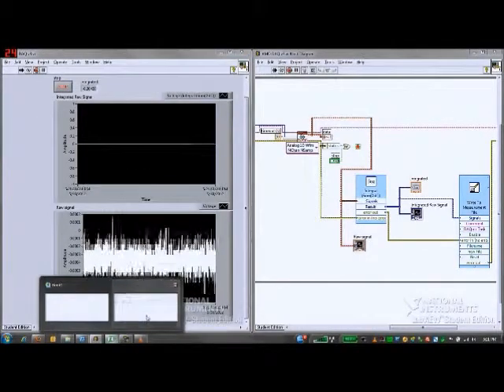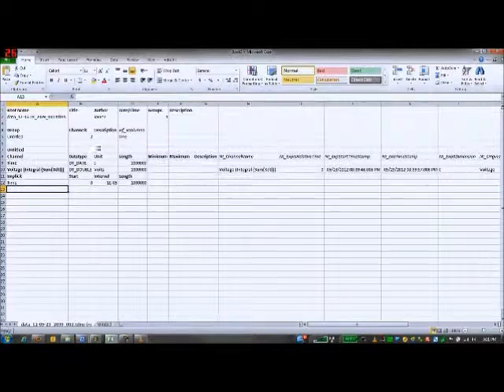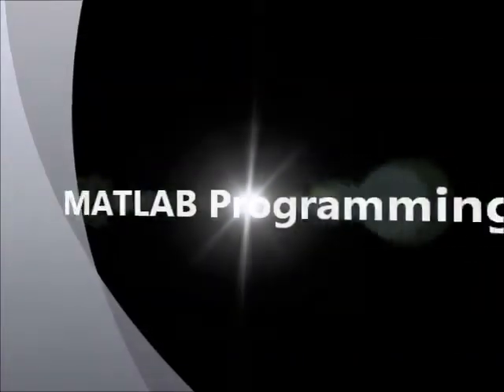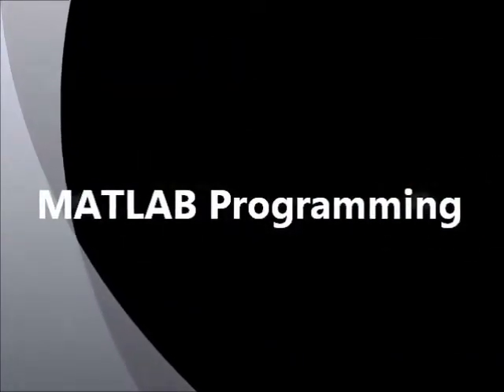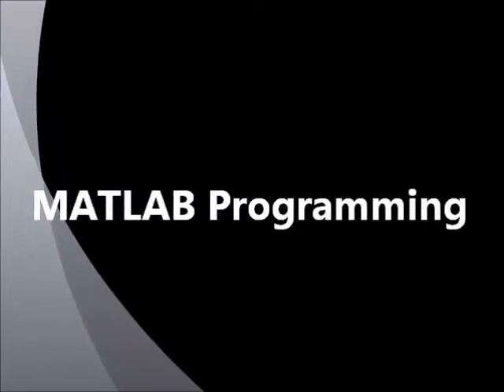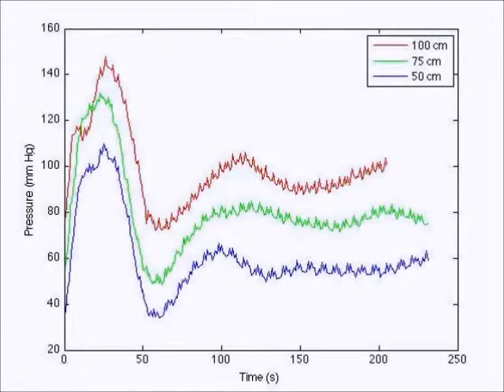The TDMS file looks something like this. This is just some basic header information that it prints out. And on the next tab, we have all our data points with timestamps, which Jack then later uses to analyze in MATLAB. So, with the data acquired, we used MATLAB to help analyze. Here are some of the basics of our analysis. For the MATLAB analysis, we converted the voltage readout to pressure.